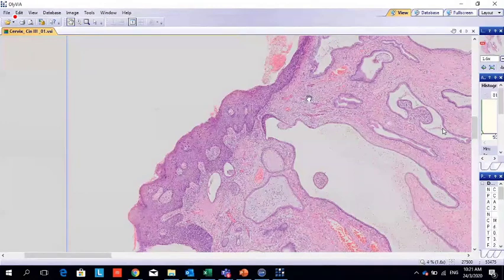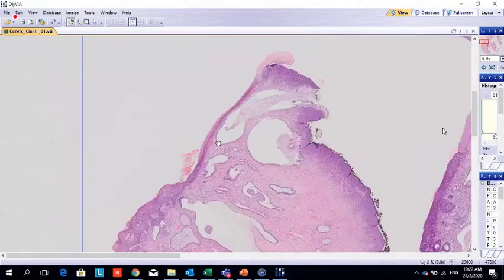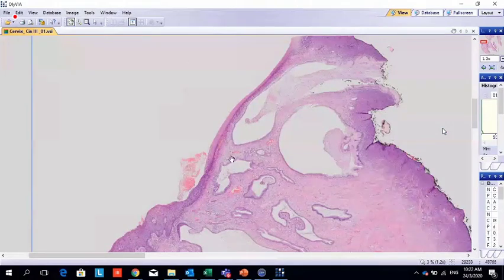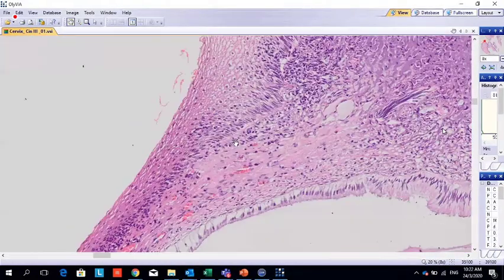So why is Pap smear such an important screening? Early detection. Yes, we can see CIN1, even before CIN1, the atypical cells. Sometimes the biopsy shows normal epithelium, but in Pap smear we can see even one or two cells starting to change.